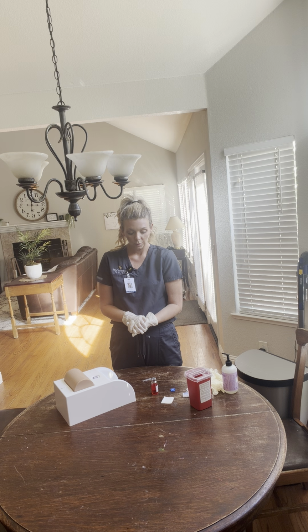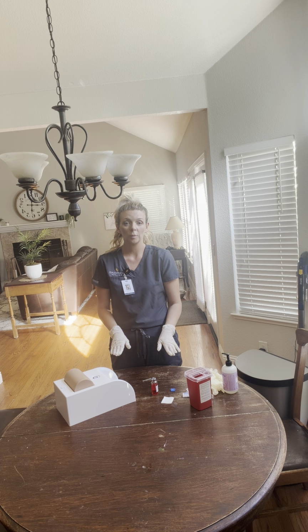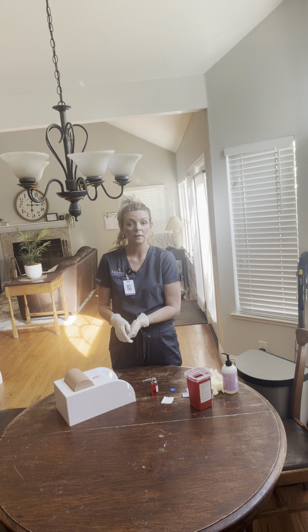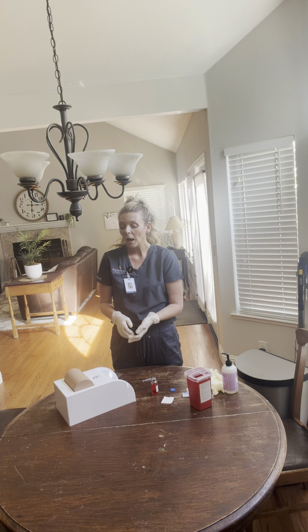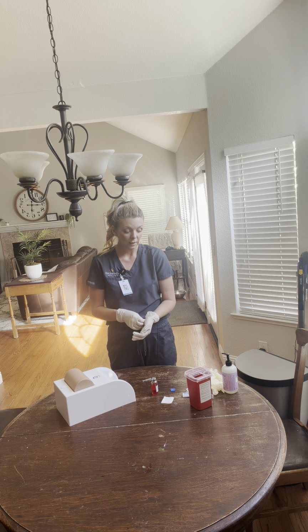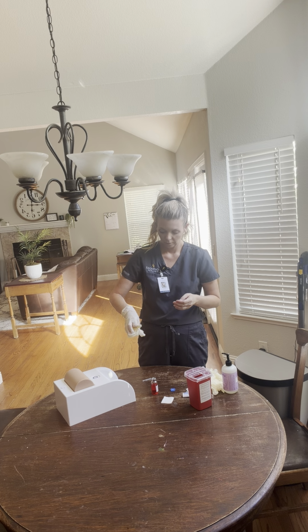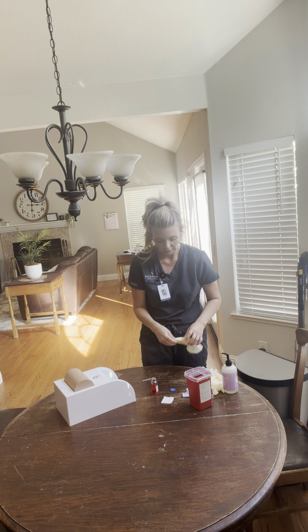And then I'm going to get ready to document. I'm also going to lower my bed to the lowest position, make sure my patient has the call light in hand in case they start experiencing any reactions, they can get a hold of me. I'm going to get ready to document. So I'm going to take my gloves off here, and I'm going to clean up my mess.